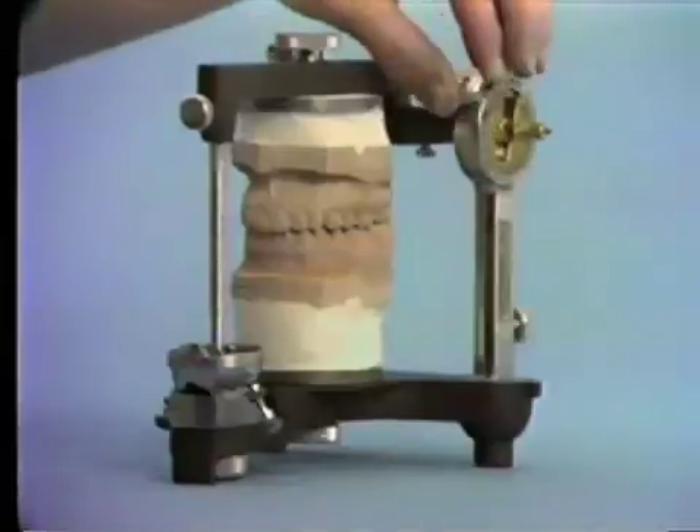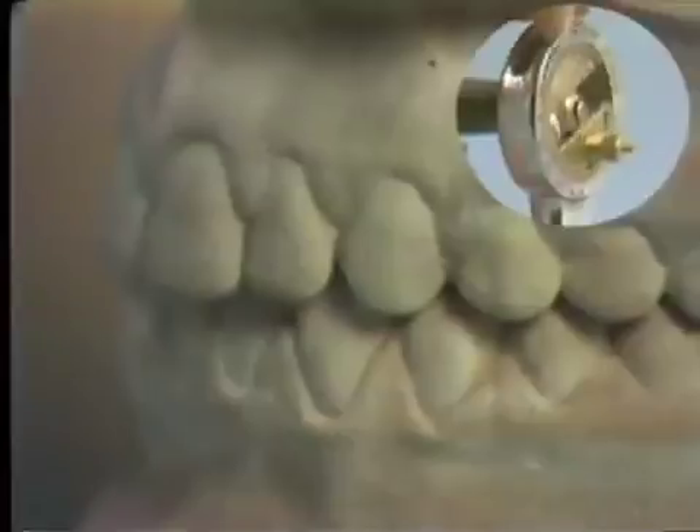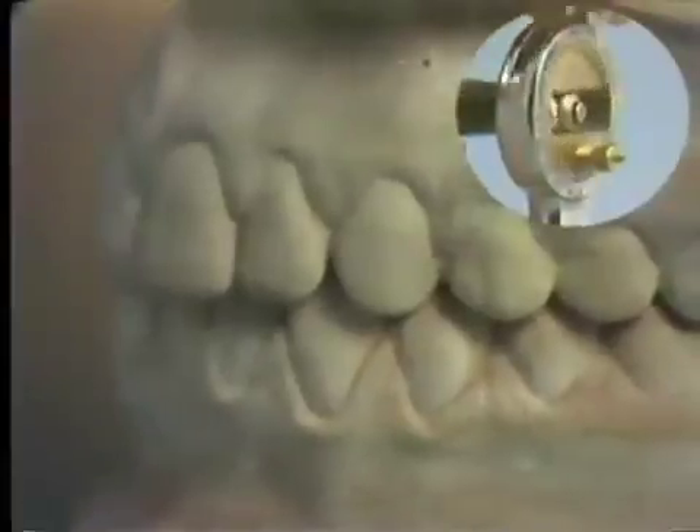If the condylar shafts and condylar elements are not at the centers of the condylar guides for all inclinations, a change in the vertical dimension will occur at differing inclinations of the condylar guidance.